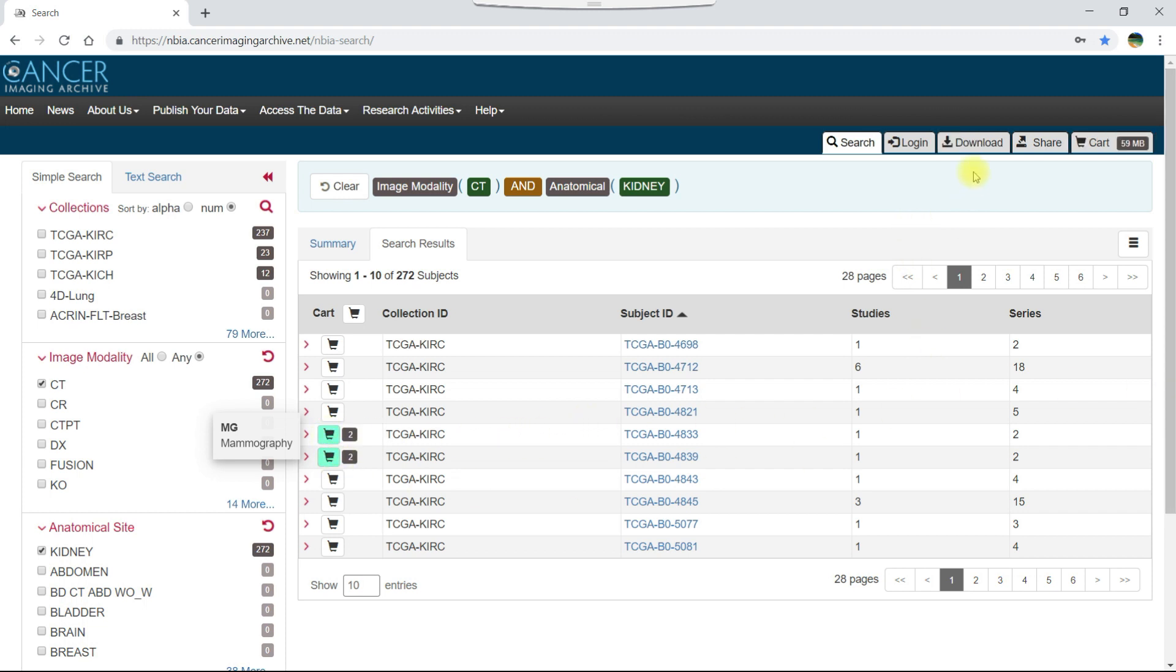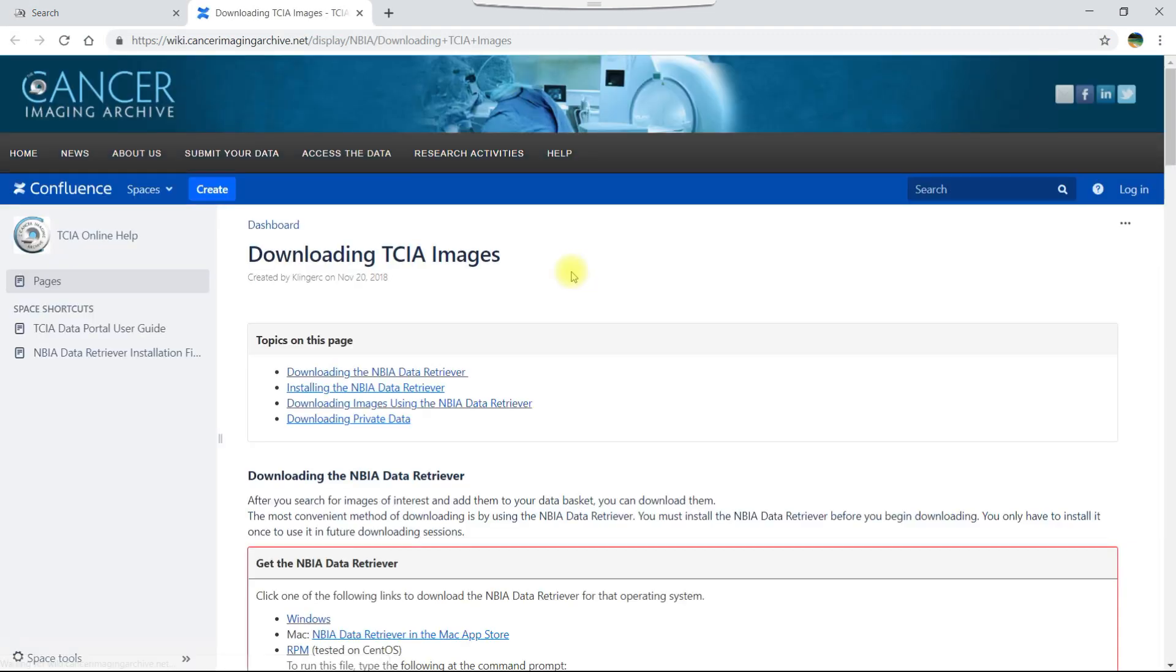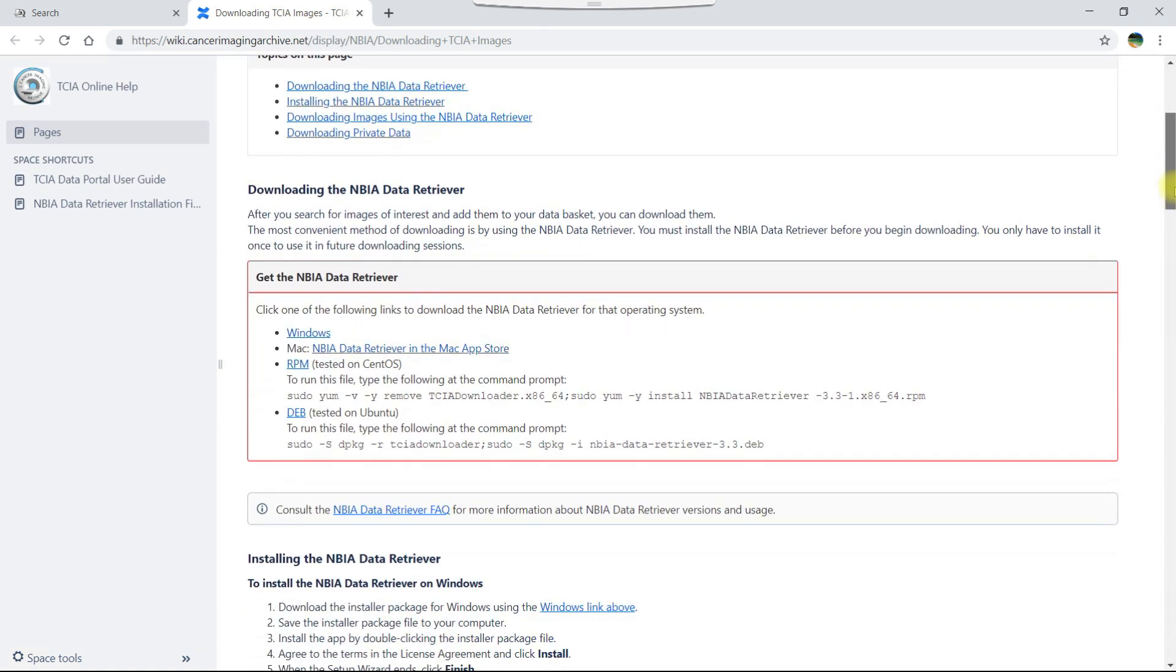Now let's click the download tab. At this point, if you haven't already downloaded the data retriever, you can click the get data retriever button to go to a wiki page with links to installation files for each operating system.